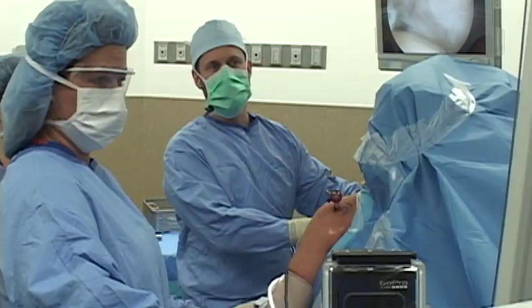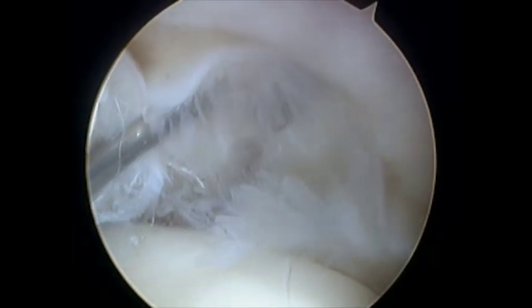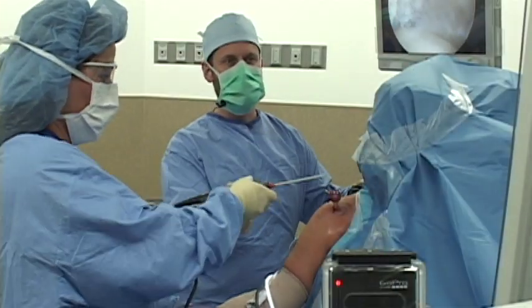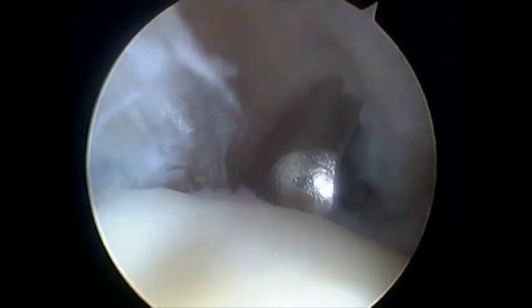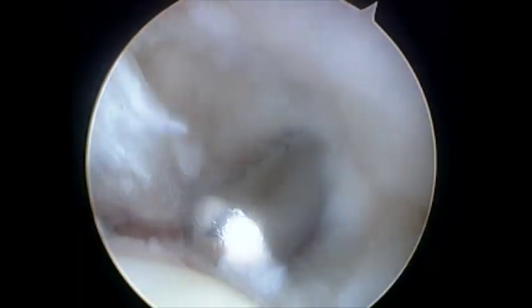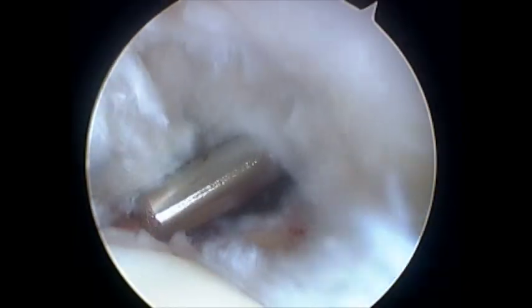Now we're going to look over to where the rotator cuff attachment is, and you can see that it looks very frayed. We'll put a spinal needle — just a needle — into that area to mark it. You can see that that's very abnormal looking, and that's where the tear in the rotator cuff is. Now we're just going to clean that area up. We're taking out torn, frayed tissue and we'll leave behind a small defect or hole. That hole is the tear itself, so all I'm doing is cleaning up the tear that was already there.